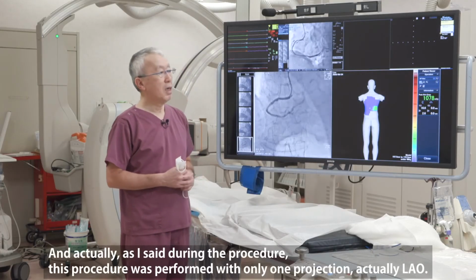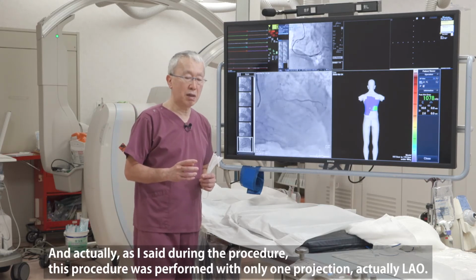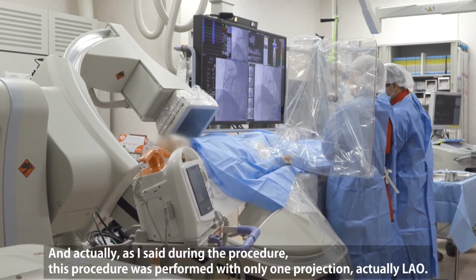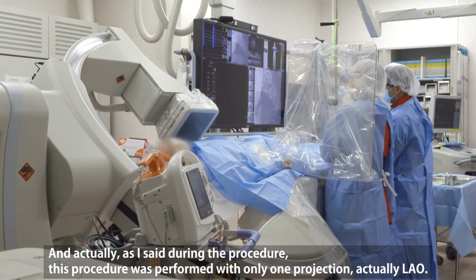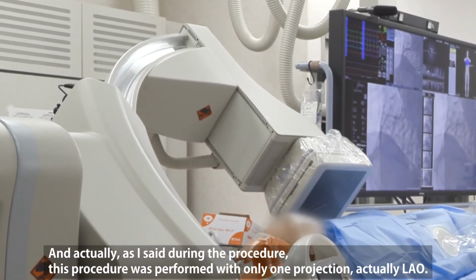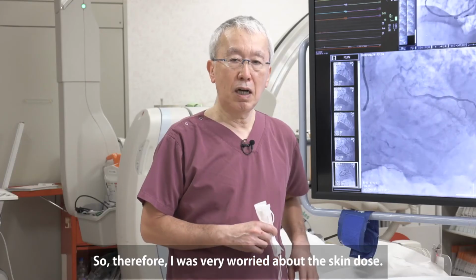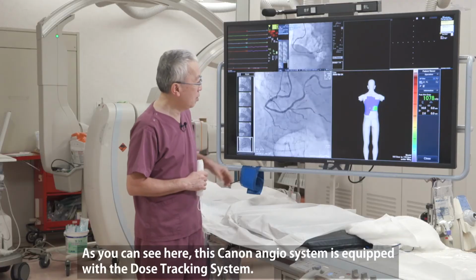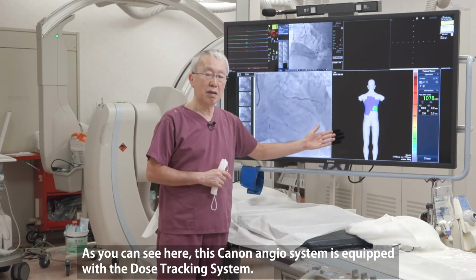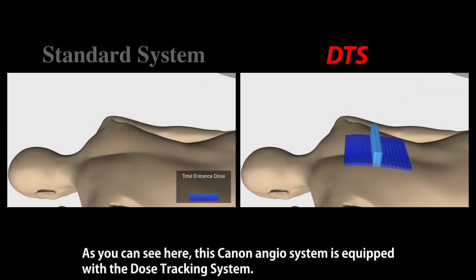And as I said, this procedure was performed with only one projection, LAO. So I was very worried about the skin dose. And here, as you can see, this Canon angio system is equipped with the dose tracking system.